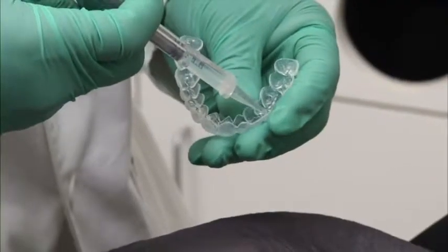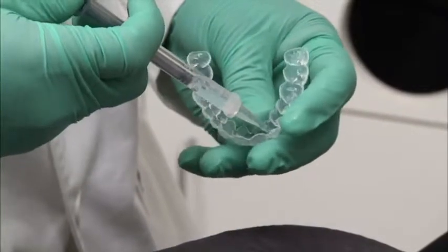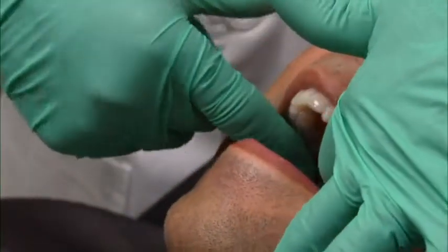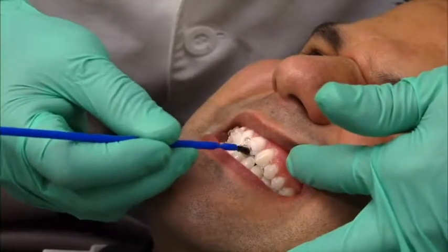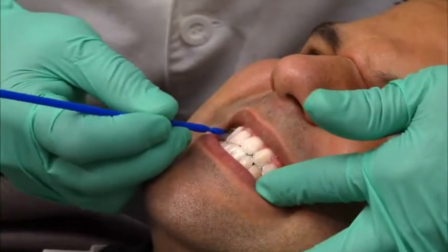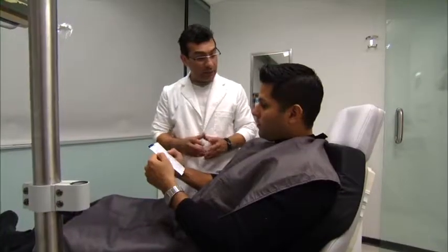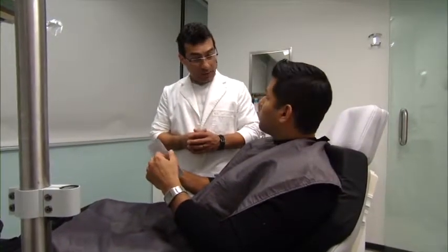Place Relief into the take-home trays and seat on the patient. Normal wear time is 10 to 30 minutes. If trays are not available, brush product onto the teeth. Instruct the patient not to spit for approximately 3 minutes. Review the post-treatment care instructions with the patient.